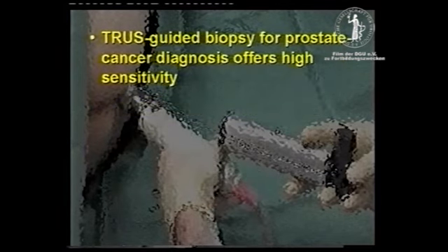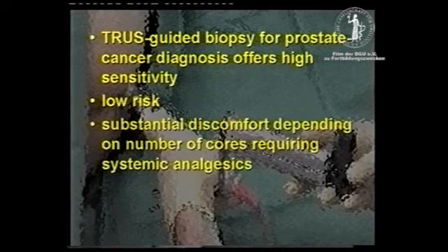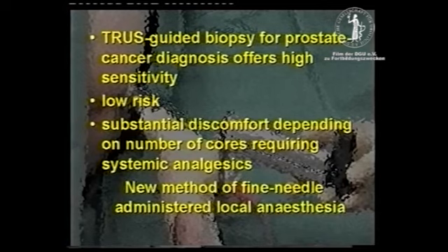Transrectal ultrasound-guided biopsy of the prostate offers high sensitivity and is of low risk, but it can cause substantial discomfort depending on the number of cores taken, requiring systemic analgesics. We developed a new method of fine needle administered local anesthesia to the prostate, eliminating biopsy-associated pain.